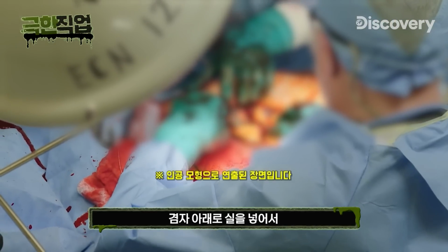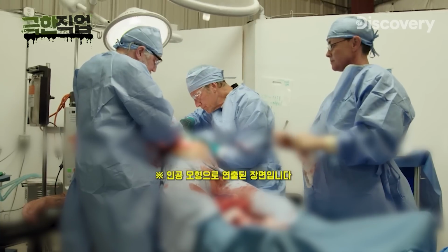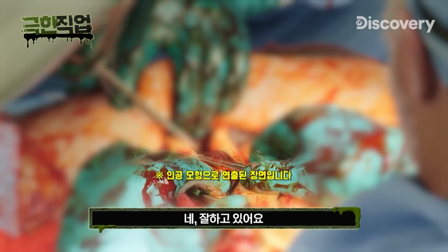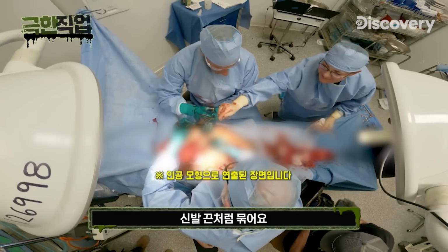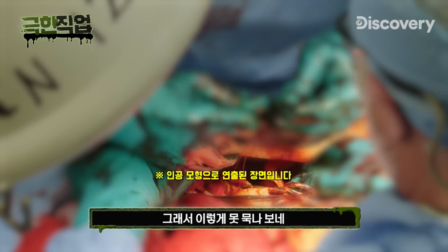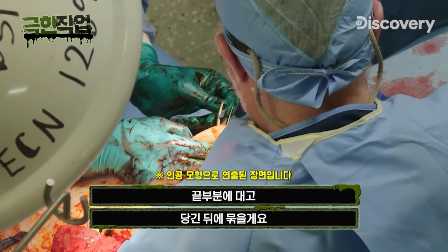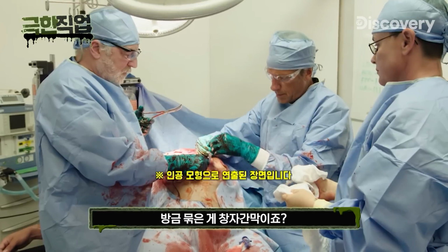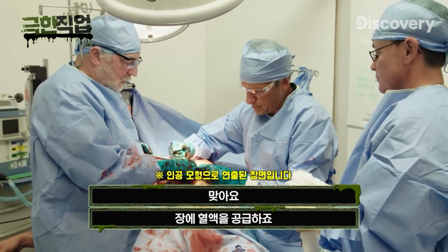You want to drive the stitch right under the clamp and right through that vessel. There you go. And then come through and grab it. Yep, it's pretty good. All right, throw down a tie like you're tying your sneakers. Because my sneakers are Velcro. Maybe there's a reason for that. Believe me. We just put it on the tip, pull it through, tie it down. And that's called the mesentery you just went through? This is the mesentery, yeah, it's the blood supply to the bowel.